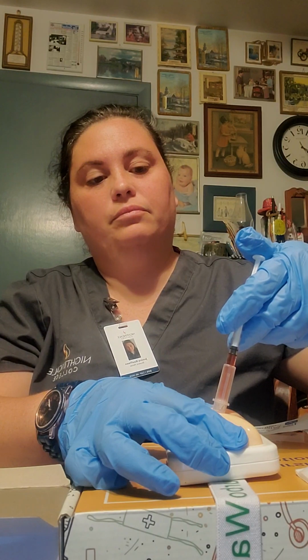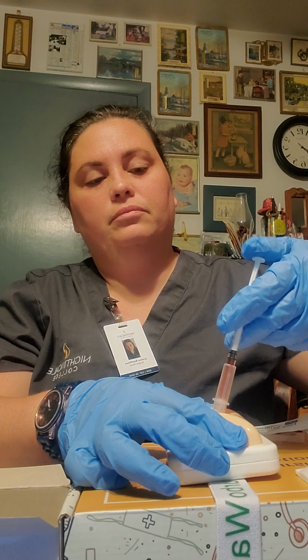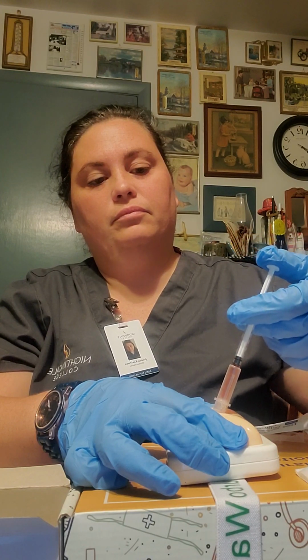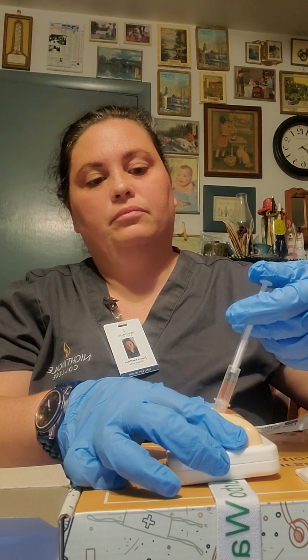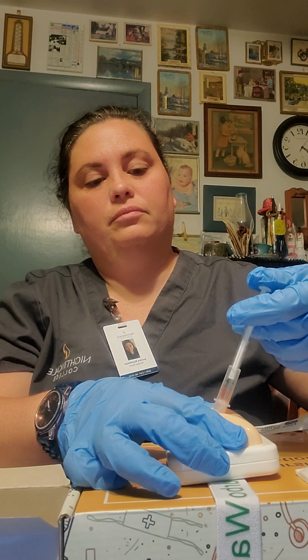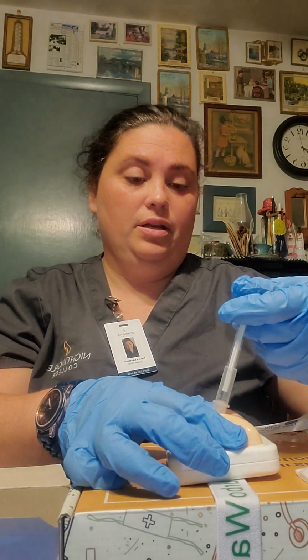Still going. Okay, all my medicine is administered.